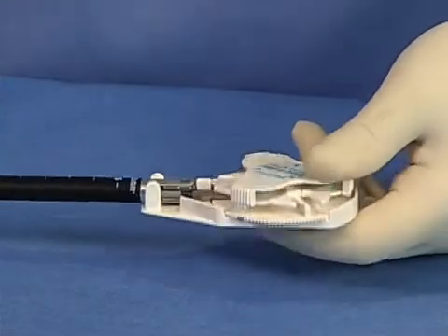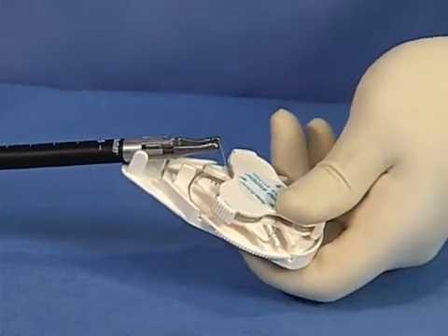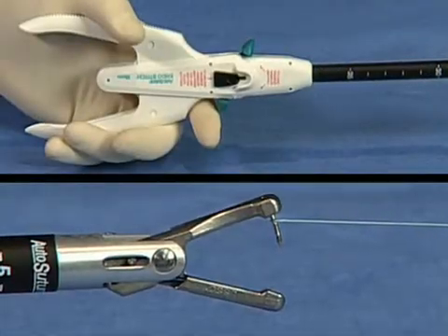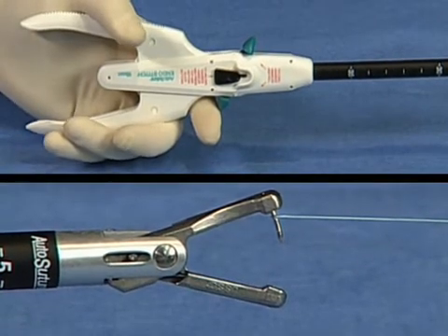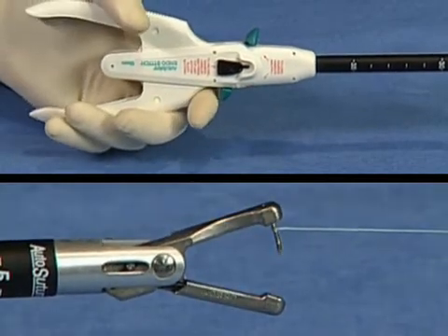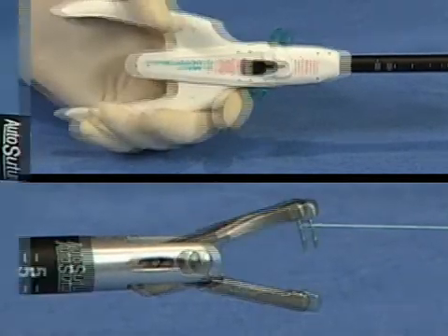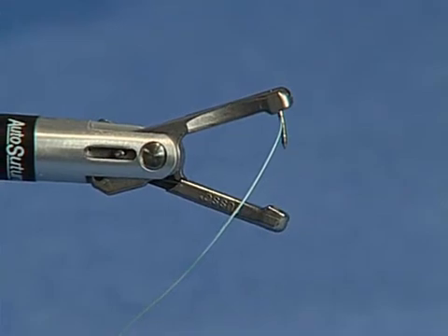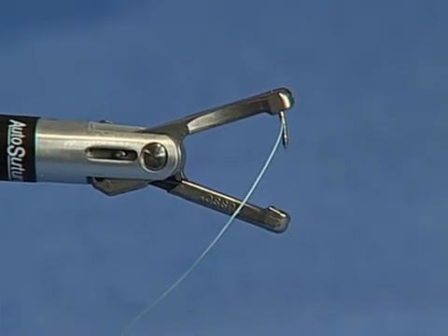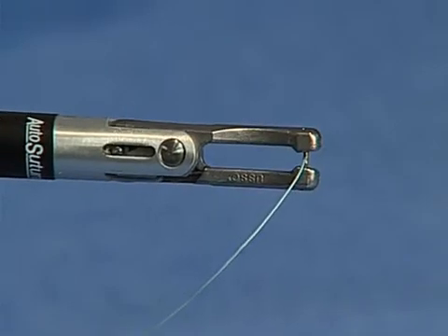Press down on the SULU tab and remove the device and entire length of suture. Test to ensure that the needle is fully seated by passing the needle back and forth between the jaws of the device by squeezing and toggling the handle. Prior to introduction of the EndoStitch suturing device through a trocar sleeve, ensure that the jaws are locked in the closed position.